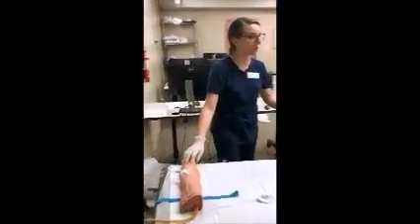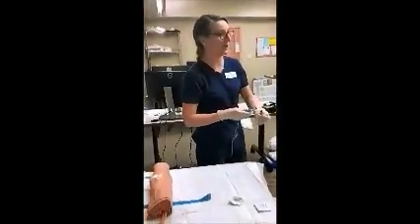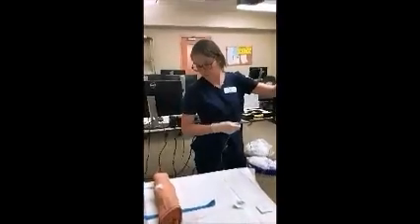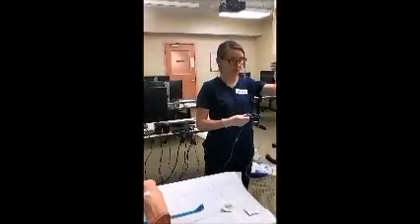Making sure we're checking in with Joe, seeing how Joe's doing. How you doing, Joe? I'm good. Oh, good. All right. Unclamp that. What are you doing? Well, I'm going to go ahead and set this drop rate for you, and that'll help get this fluid into your arm. All right. Yeah. It'll make you feel a little better, too. Sounds good. All right. So I'll set the drop rate here.